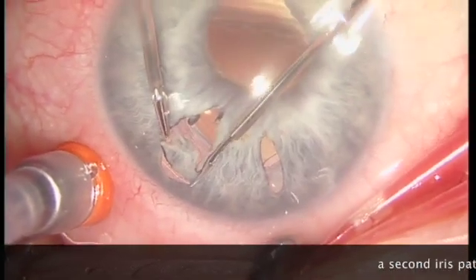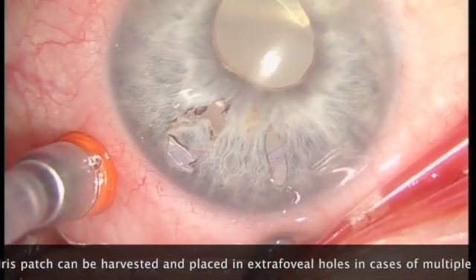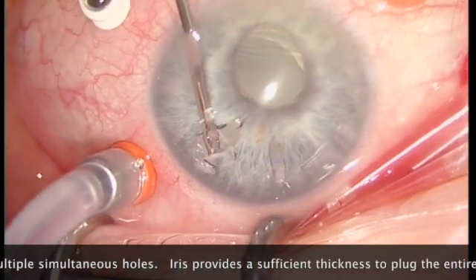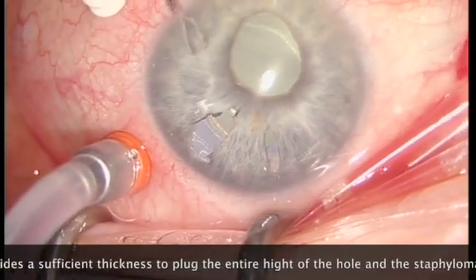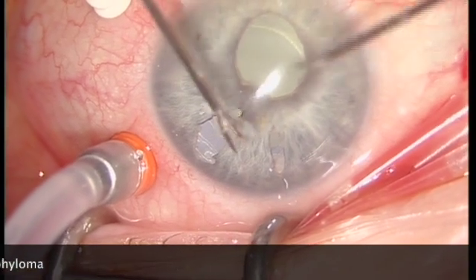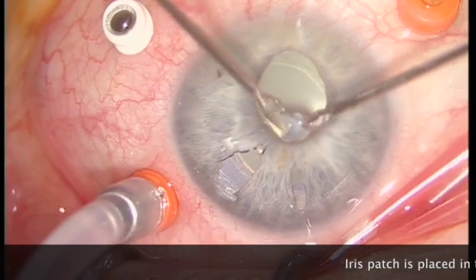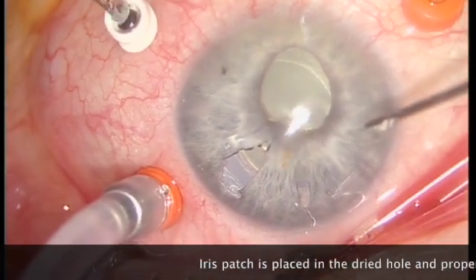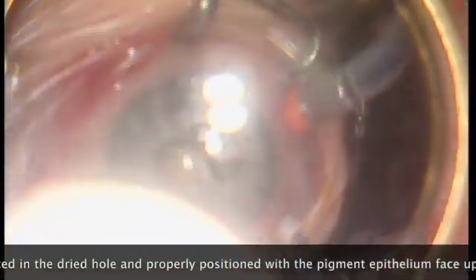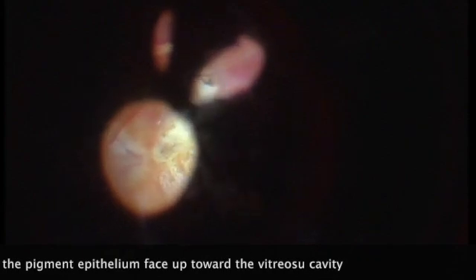A second iris patch can be harvested and placed in extrafoveal holes in cases of multiple simultaneous holes. Iris provides sufficient thickness to plug the entire height of the hole and the staphyloma. The iris patch is placed in the dried hole and properly positioned with the pigment epithelium facing up toward the vitreous cavity.